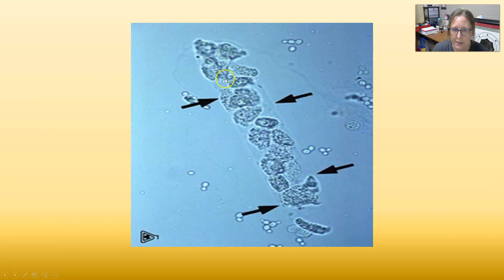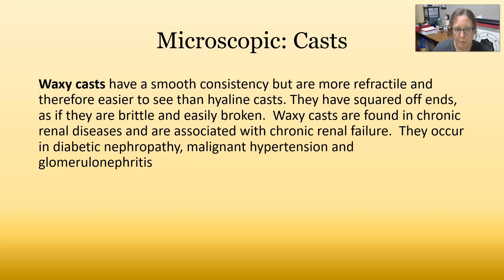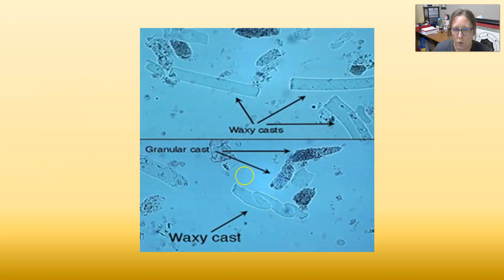This is a cellular cast — you can see the outline of the cast and the cells stuck inside it. Waxy casts have a smooth consistency but are more refractile and therefore easier to see than hyaline casts. They have squared-off ends, whereas hyaline casts tend to have rounded ends, as if they were brittle or easily broken. Waxy casts are found in chronic renal diseases and are associated with diabetic nephropathy, malignant hypertension, and chronic renal failure. These are what waxy casts look like — the straighter edges make them more prominent and easier to see. That wraps up our microscopic topic video.